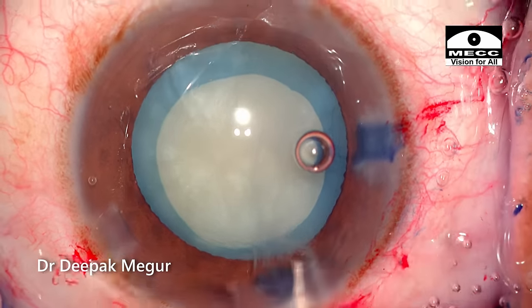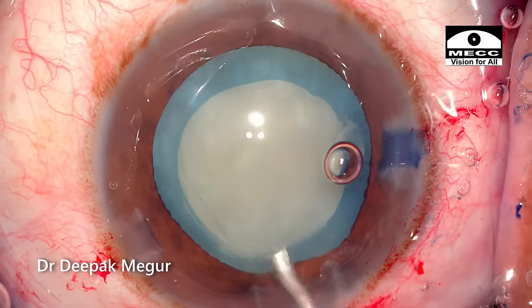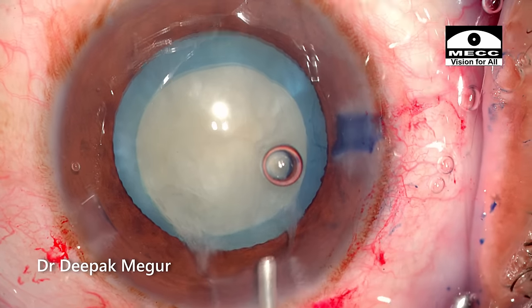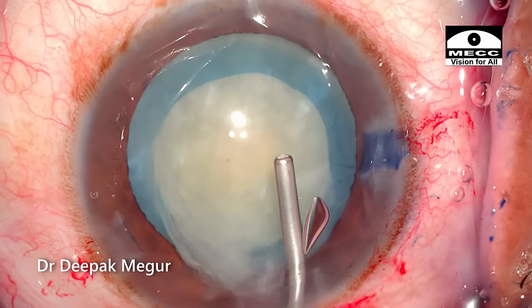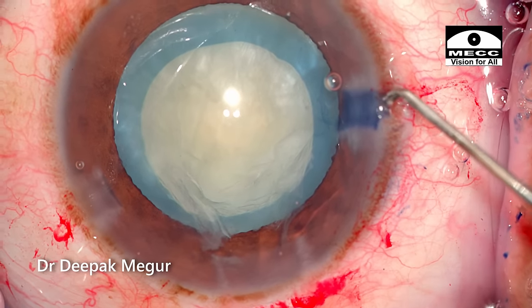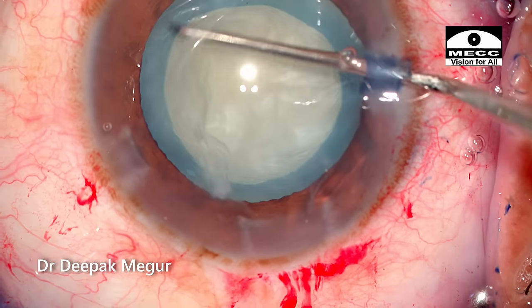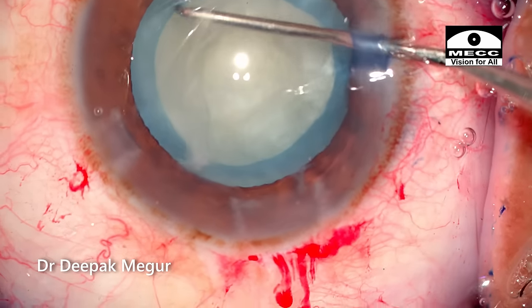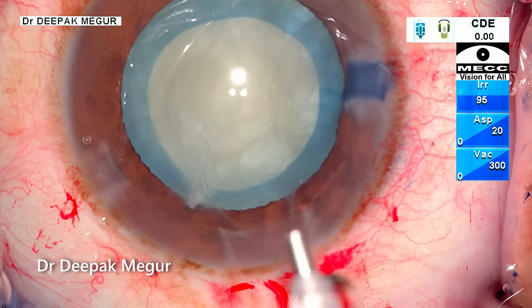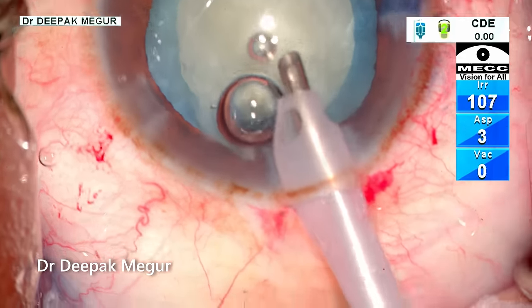A gentle hydrodissection is being performed. Just tap the nucleus to ensure that it's mobile. HPMC is reinstated into the anterior chamber. Time to perform the phacoemulsification. Initially the settings are in the epinucleus mode and I am aspirating the superficial cortex and epinucleus.